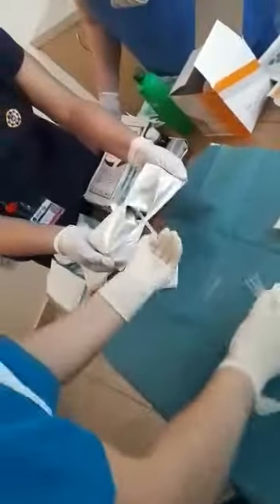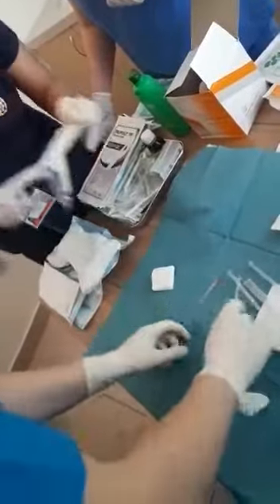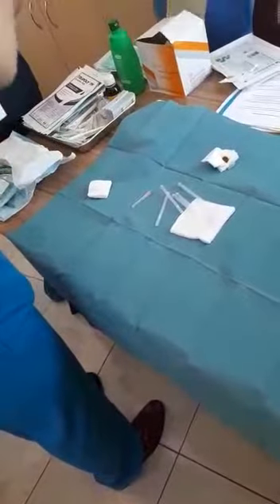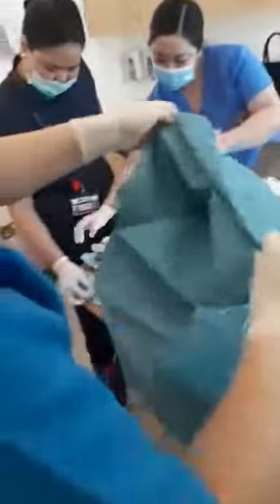Okay, that's yours. 1, 2, 3, 4, 5. Yes. Here we are. Perfect. Another drape like this. And this again. Okay. And please assist you. Thank you very much.